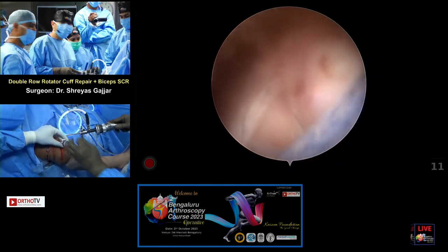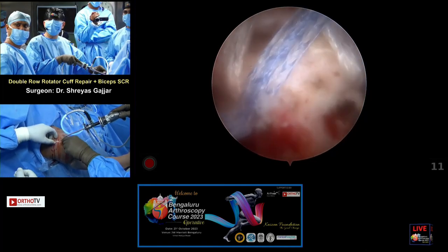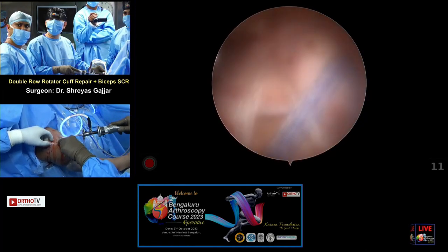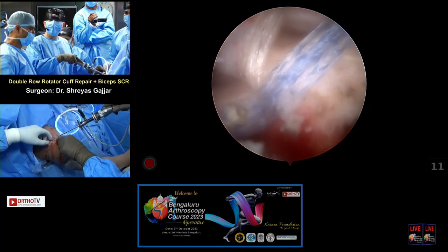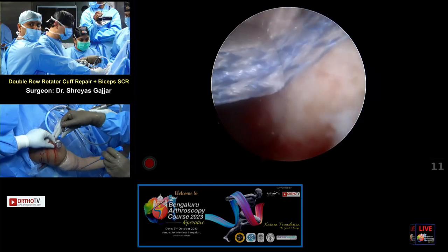Okay, and then again, to give you an idea, use the cannula as a reduction tool so you know exactly how it is. So this is how the repair is going to look. Okay, now have the punch, please. Punch, please, right? Yeah, punch. Thank you.